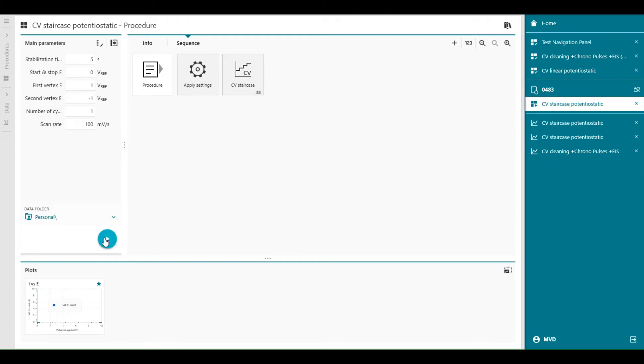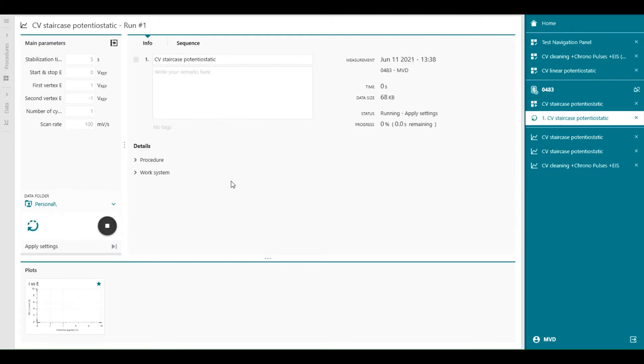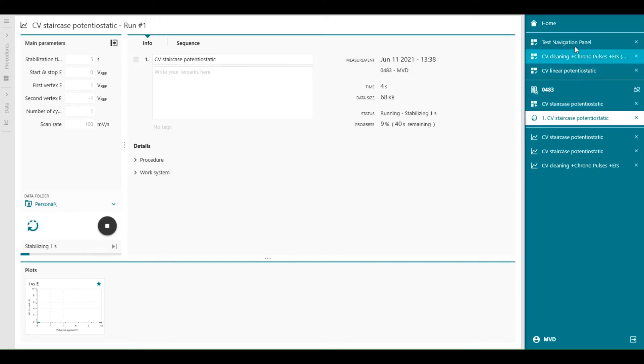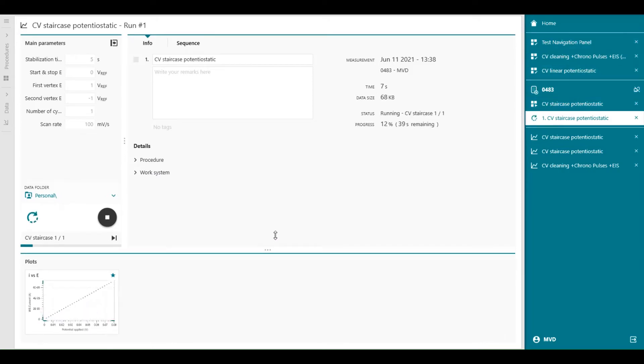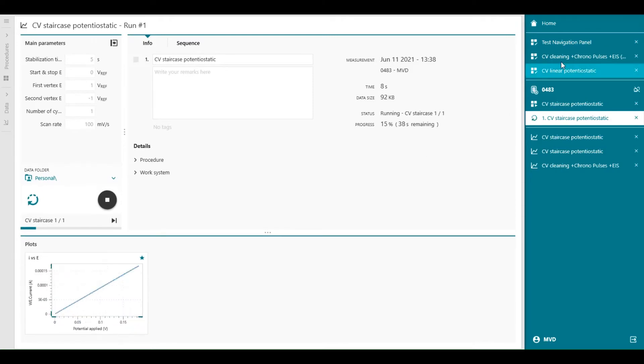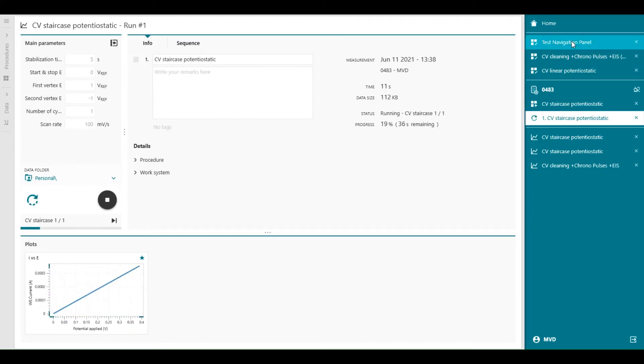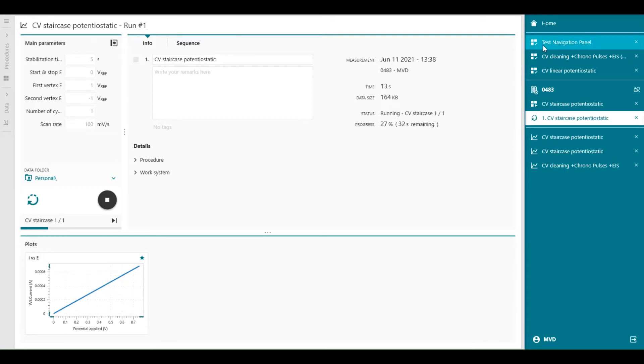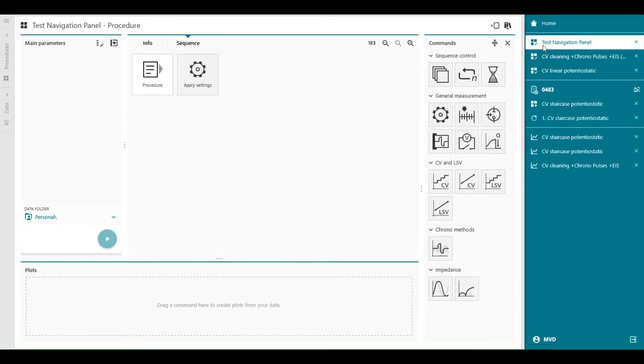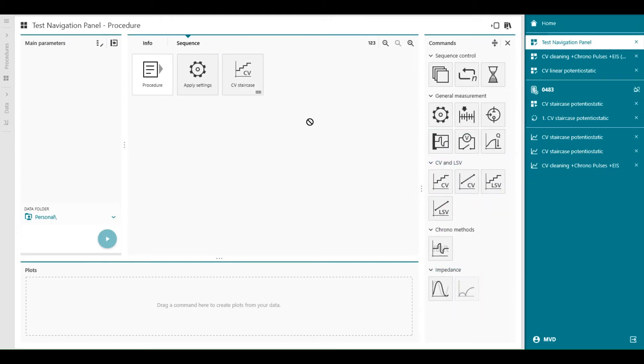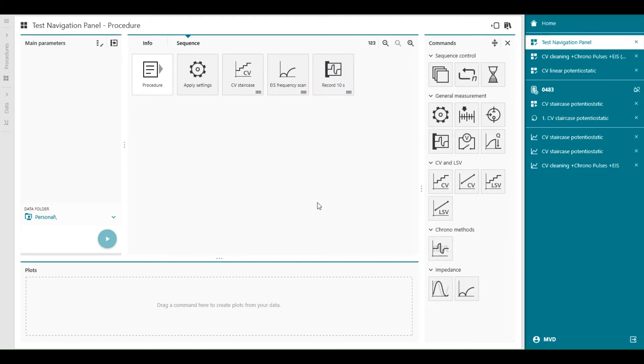During the measurement, so we can start this procedure. During the measurement, we can also continue with our not defined procedures yet. So we can open the test navigation panel, and we can modify and start working on our procedure by just drag and drop commands inside the sequence.